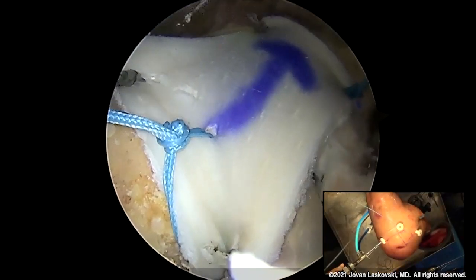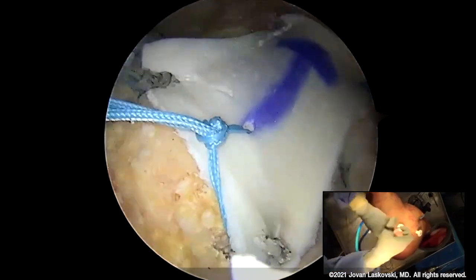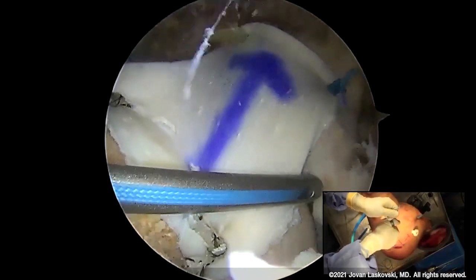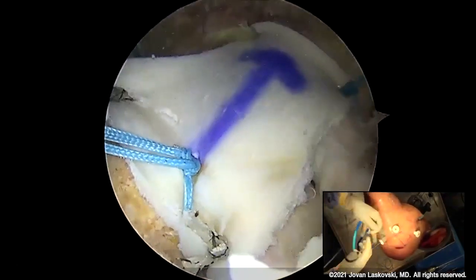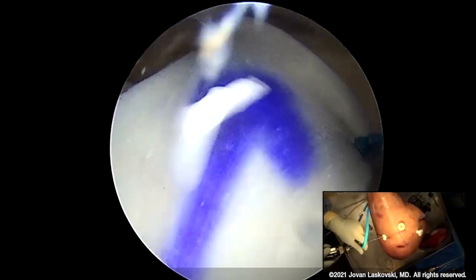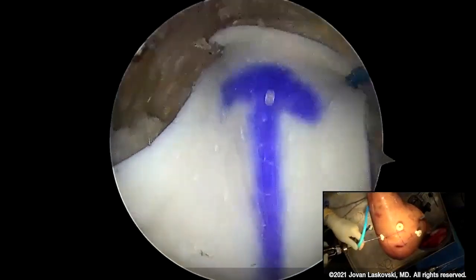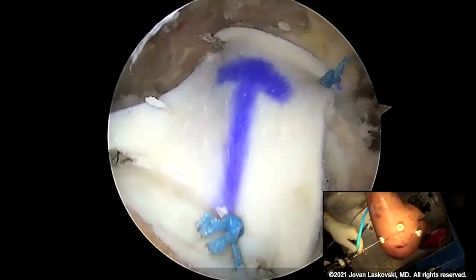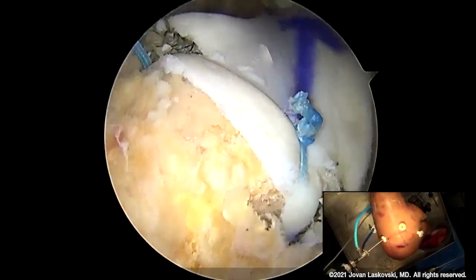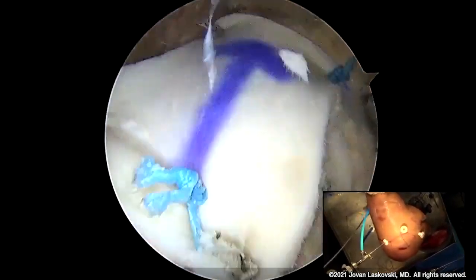You can see the contour of the graft to the humeral footprint — that's why I like these simple sutures and their vector of pull. It's going to pull it toward where you want, giving you nice overall tension. We've got great contour to the glenoid, suture anchors nicely tied, and excellent overall tension of that graft. We can do a little internal and external rotation and see the graft move with us. Superior migration of the humerus is nice and well controlled.